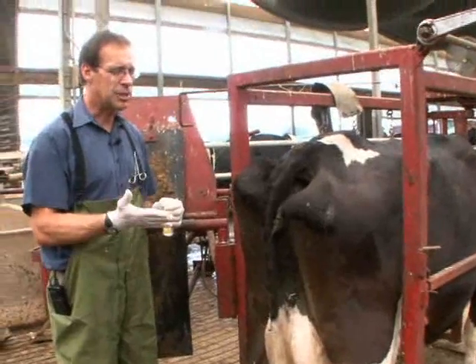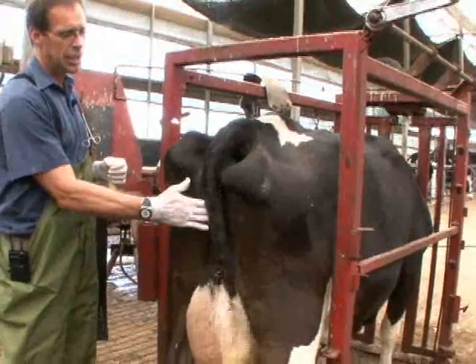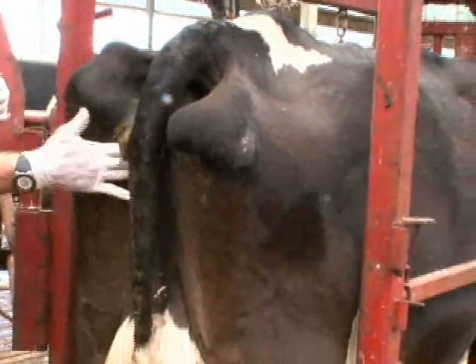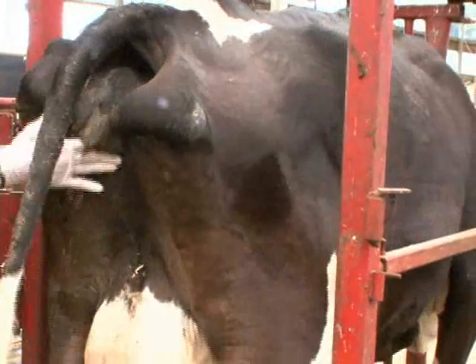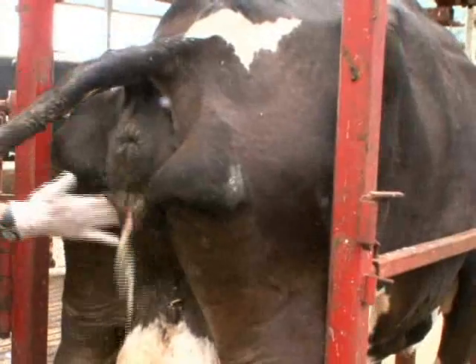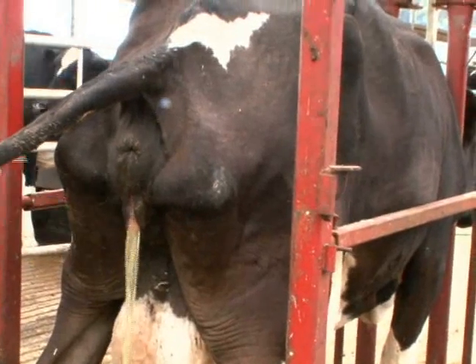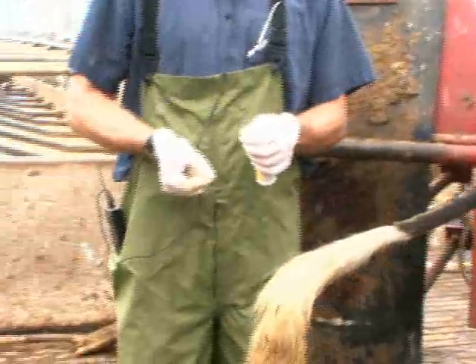What I like to do is use the flat part of my hand just underneath her tail and just below her vulva lips, and start to gently stroke up and down, being very consistent and continuing to apply a bit of pressure. Once she begins to urinate, she will posture and start to urinate, and during the full urination stream you can pass your keto strip underneath the urine stream to collect a sample.